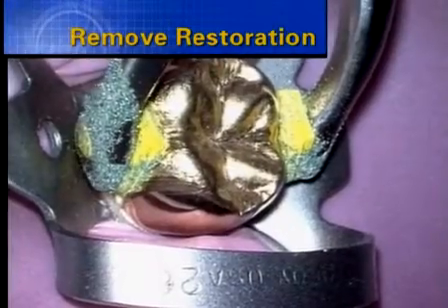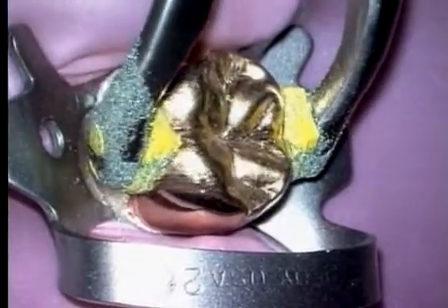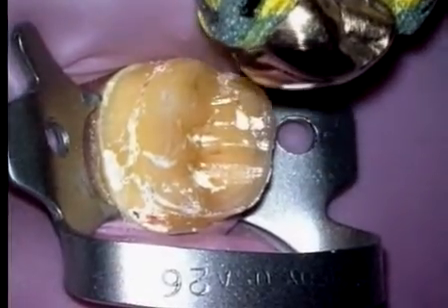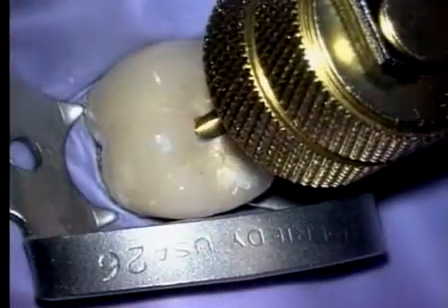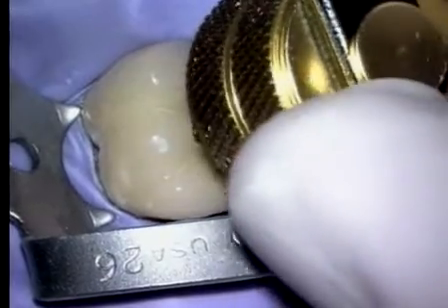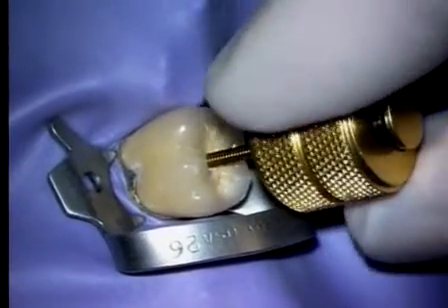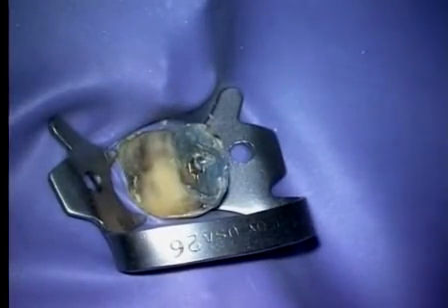In provisionalized dentistry, it's excellent to use a GC plier with yellow packings. These are dipped in emery stone to prevent dangerous slippage. By removing the crown, we have better orientation to the underlying tooth structure, and we're also closer to the pulp chamber. In restorations that have been definitively cemented, we need to use something like the metal lift. This device allows us to push down on solid tooth structure while at the same time lifting up on the dentistry. We need to be mindful, though, if porcelain flexes 1/10,000th of an inch, it will fail.